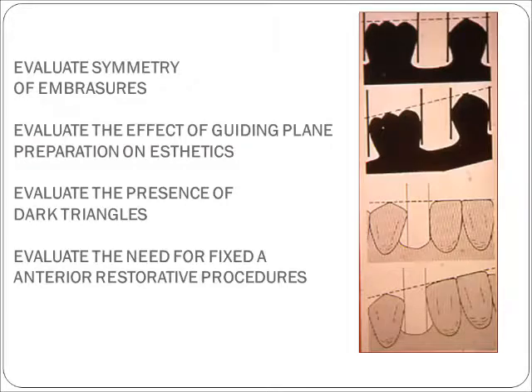Embrasure spaces may be evaluated for symmetry. Symmetrical embrasure spaces will be more aesthetic. Embrasure spaces are also evaluated for the effect of guide plane preparation. Occasionally, guide plane preparation may be minimized or may be made more aesthetic by judicious tipping of the cast.